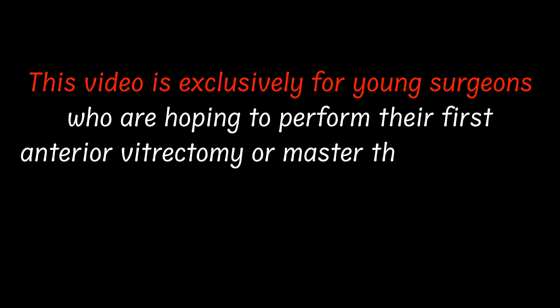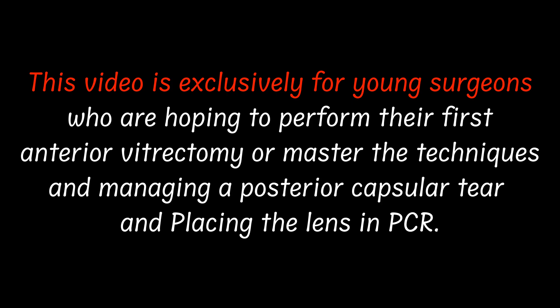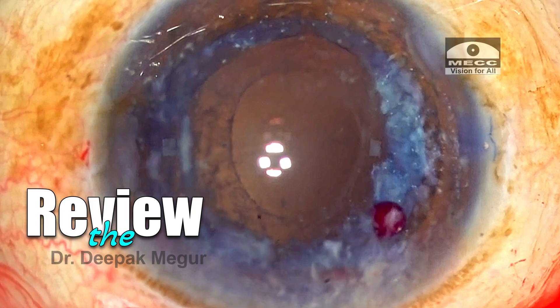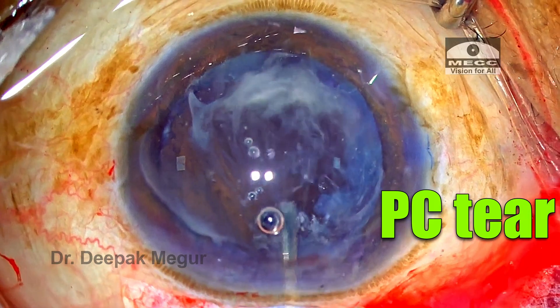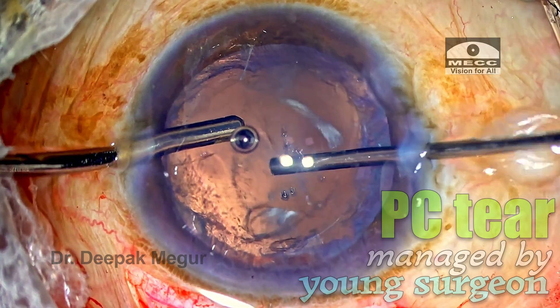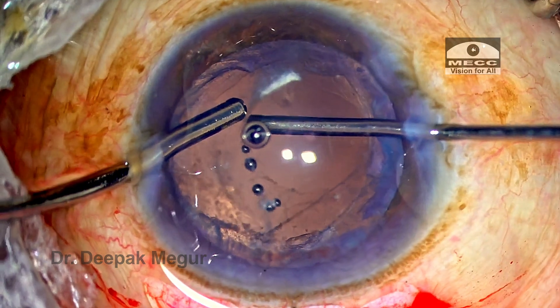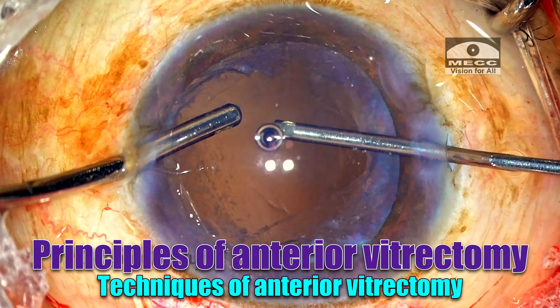This video is dedicated to all the young surgeons who are trying to perform their first anterior vitrectomy or to learn how to manage a posterior capsular tear. I'll be reviewing one such case where a posterior capsular tear was managed by a young senior resident, taking you through the case and providing commentary on the principles of anterior vitrectomy and the technique of performing it.